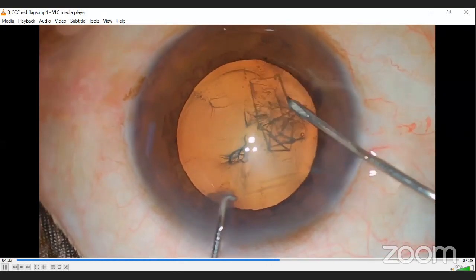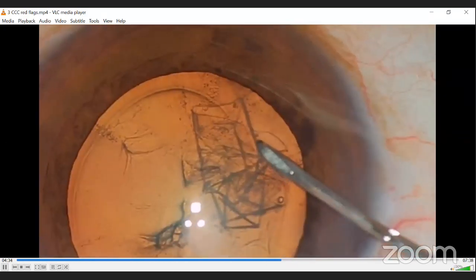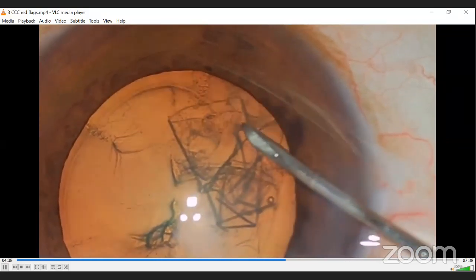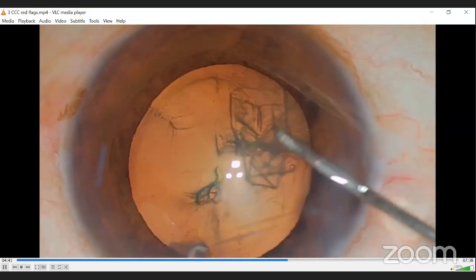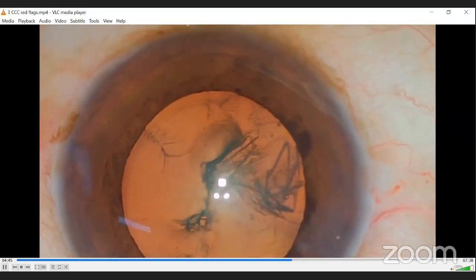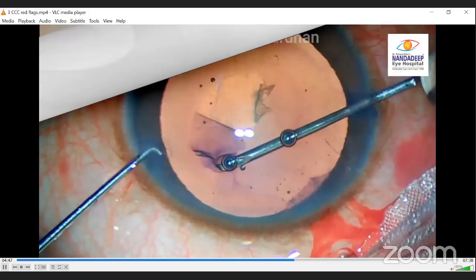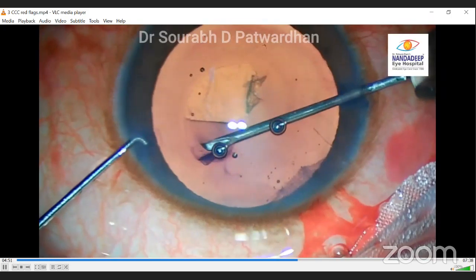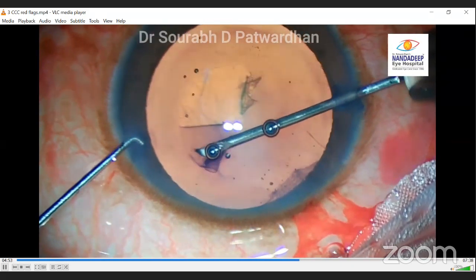So there is always an outward pull. See here, there is an outward pull on the Capsulorhexis edge. So this is what happens when the visco leaks from the antechamber and you are lazy not to replenish it. Of course, he could pull it back with a little maneuver, but you have to understand it. It is a red flag if the antechamber is becoming shallow.